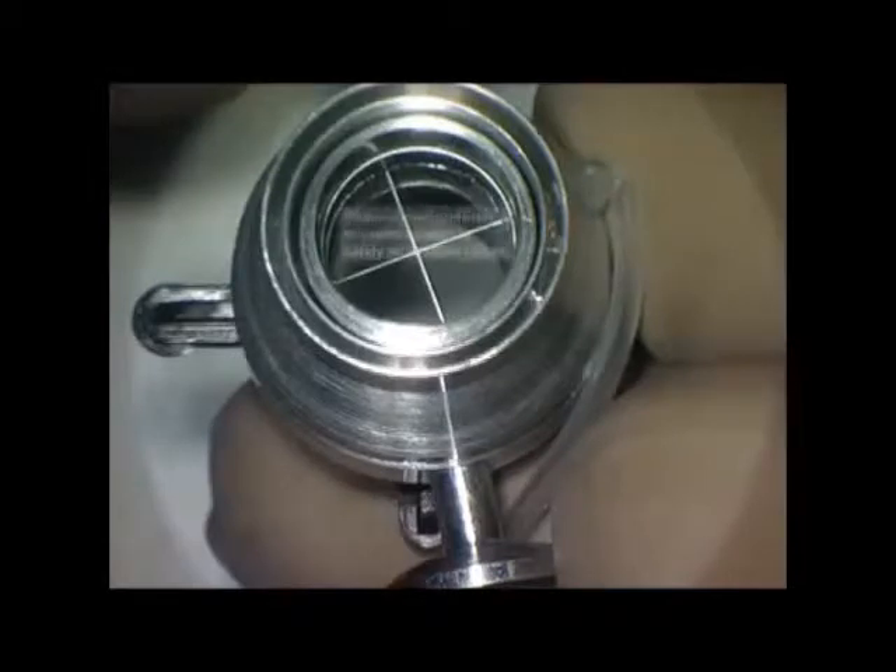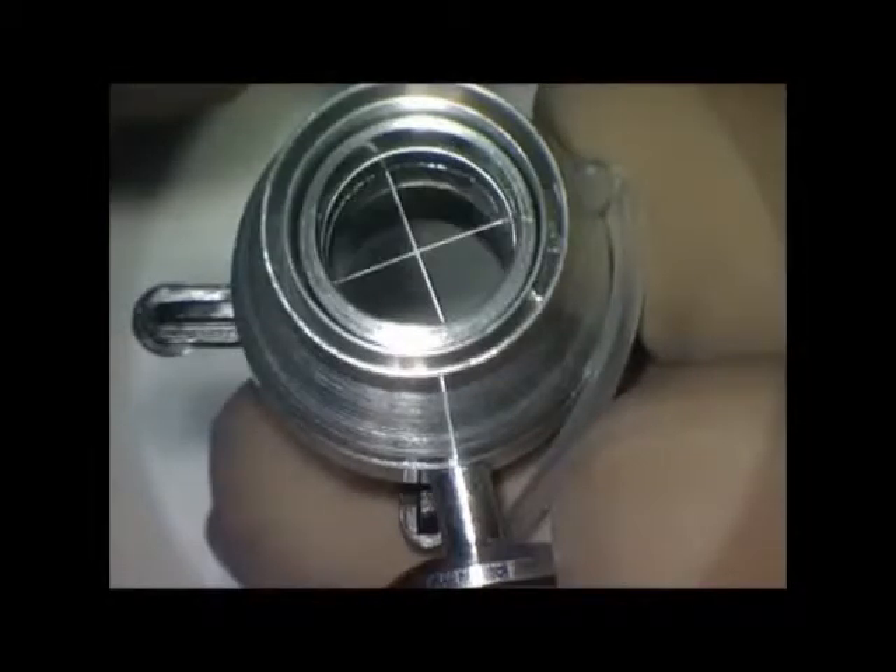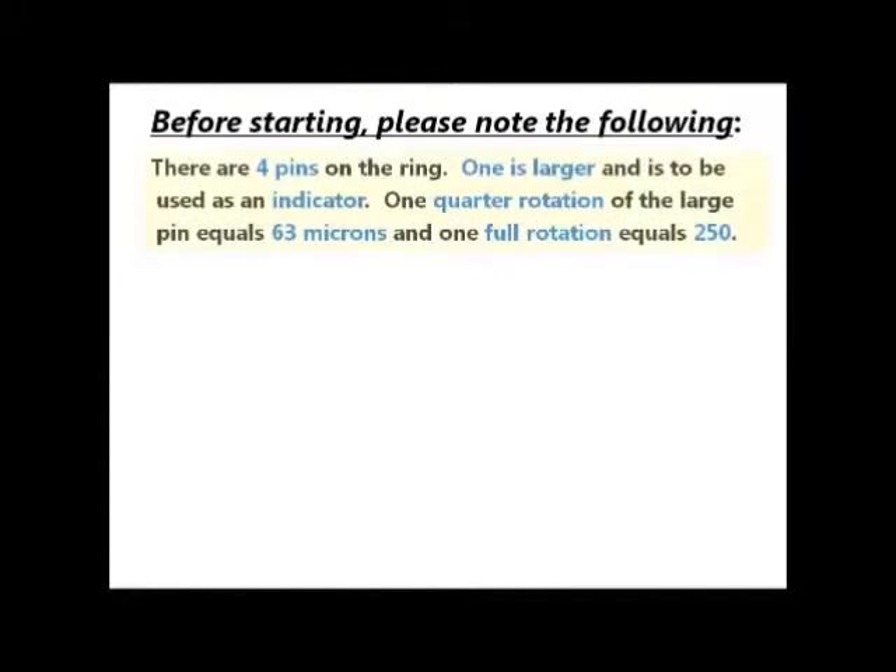Look under the microscope and observe that the cutting edge is safely inside. This graphic illustrates how to set the trephine depth. See the four pins, one of which is larger and serves as the lead indicator.